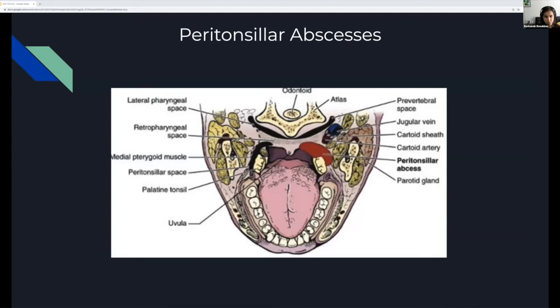A little more anatomy. You see the peritonsillar space behind your tonsils, and here you have a peritonsillar abscess. Note how close the carotid artery is to the posterior wall of the abscess. That's important because when you're aspirating you obviously don't want to poke the carotid artery — that would be less than ideal. Ultrasound can help you visualize this better, but in general the carotid is very close to the posterior wall.